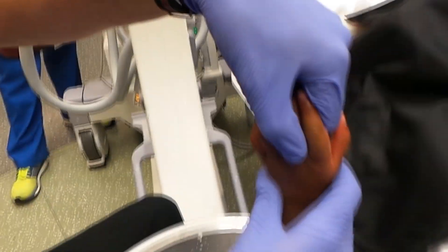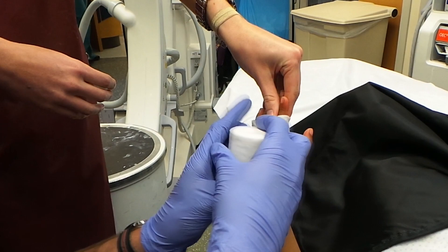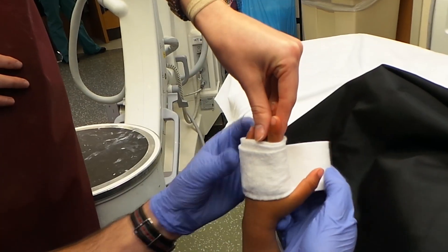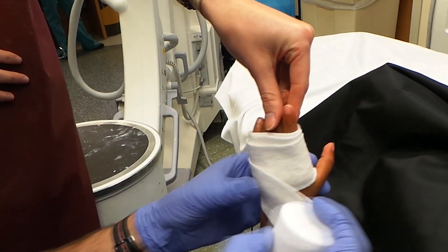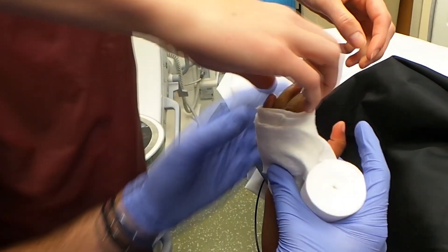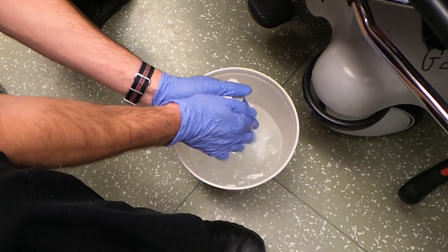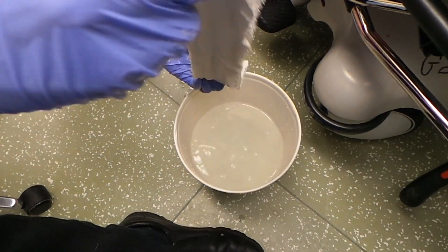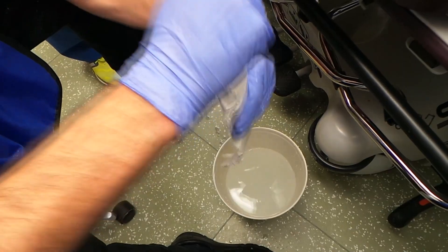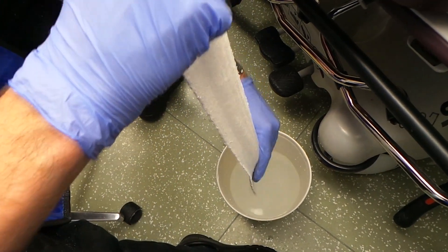We'll just get her splinted. A couple very simple splinting tips: avoid any wrinkles or dimples in the webril as much as possible. This splint should extend all the way out to her MCPs. You want your water to be cool to warm but not hot. Squeeze out the excess water over the bucket, then laminate the individual plaster leaflets to one another.